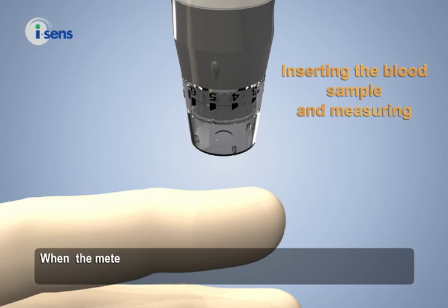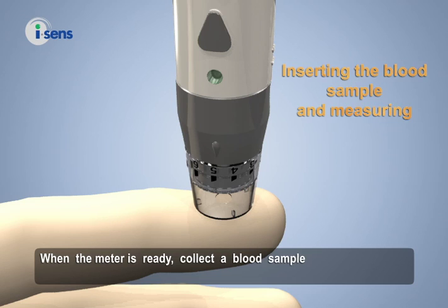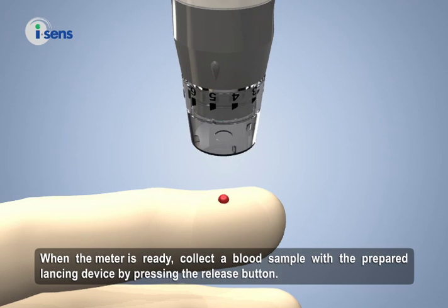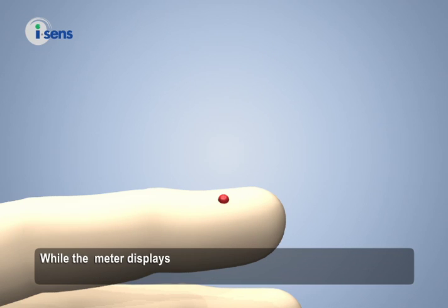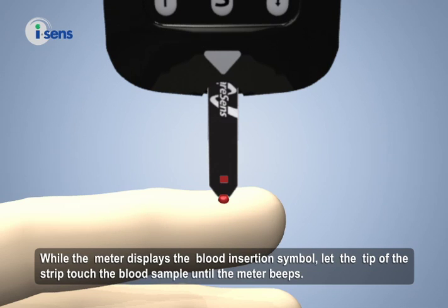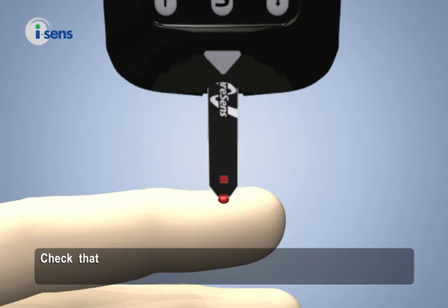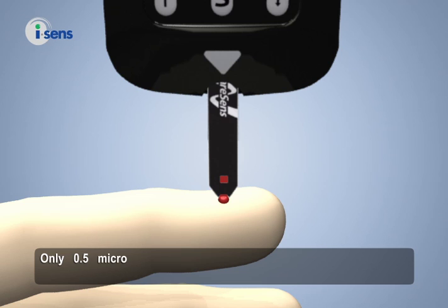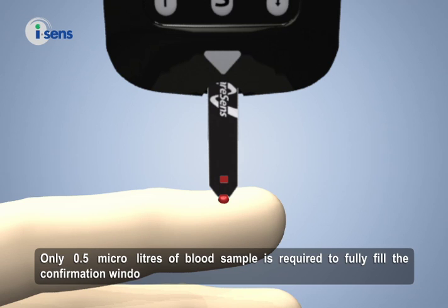When the meter is ready, collect a blood sample with the prepared lancing device by pressing the release button. While the meter displays the blood insertion symbol, let the tip of the strip touch the blood sample until the meter beeps. Check that the confirmation window of the strip is filled with the blood sample — only 0.5 microlitres of blood sample is required to fully fill the confirmation window.